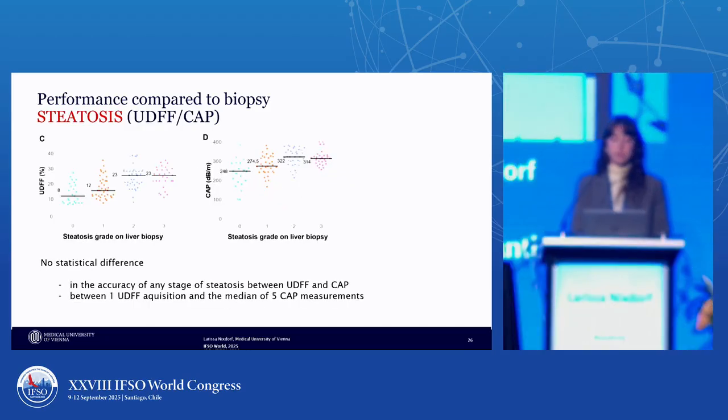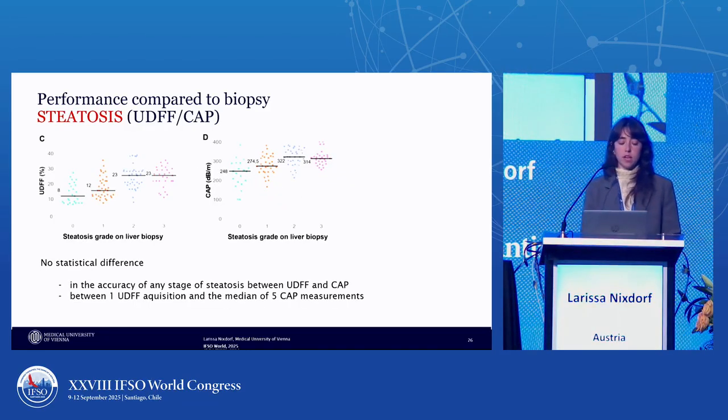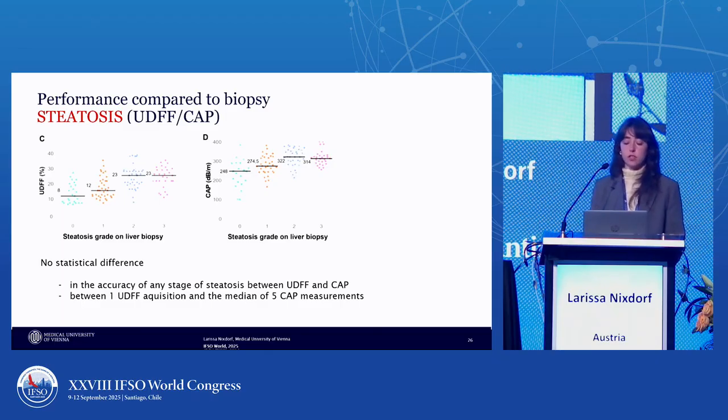The same goes for the steatosis assessment. Also on the left side, you have the newly developed ultrasound-derived fat fraction. On the right side, the controlled attenuation parameter. And also here, there were no statistically significant differences in the accuracy between those two non-invasive methods compared to the biopsy. And also here, one ultrasound-derived fat fraction acquisition was equal to 5 measurements of the controlled attenuation parameter.